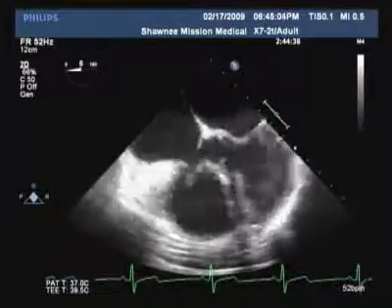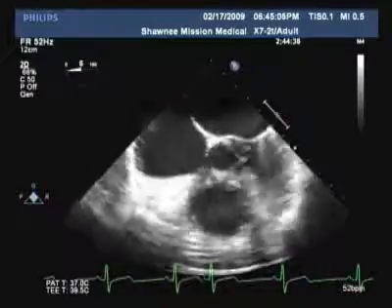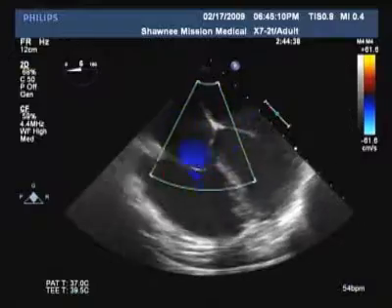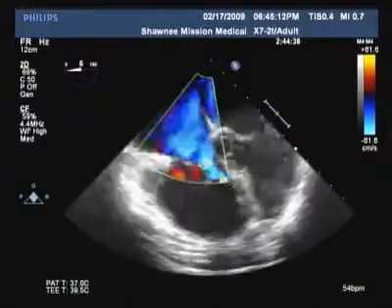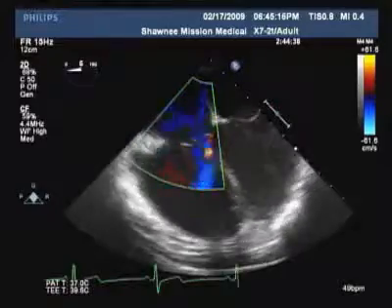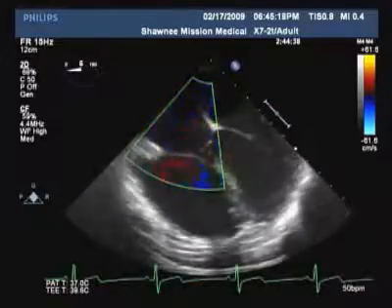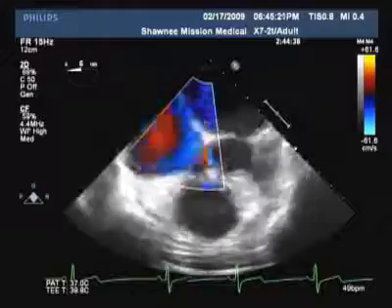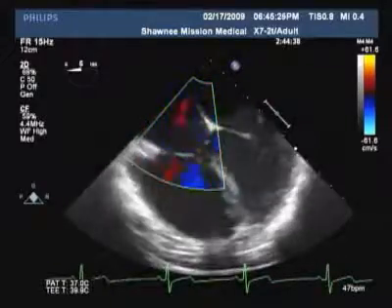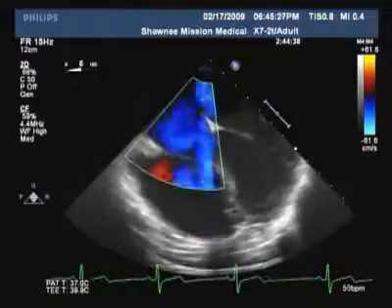See the whole thing. We're going to now put some color over here on the right side of the heart, the tricuspid valve. And this is a part that goes to the lungs, is that right? That's exactly right. So blood flow's coming down through that top chamber on the left, through that tricuspid valve that we got some color going across now, and goes into the bottom chamber on the right. From there goes to the lungs and comes back into that top chamber over on the right, through that mitral valve, down into the left ventricle, always called the pumping chamber somewhat of the heart.